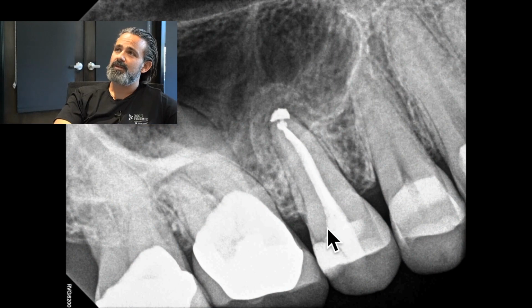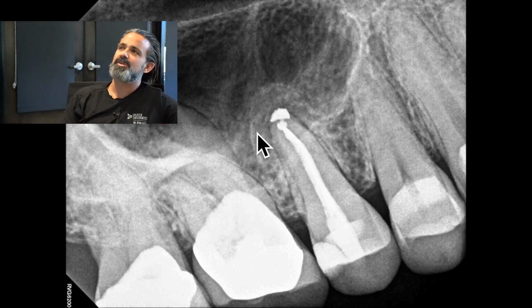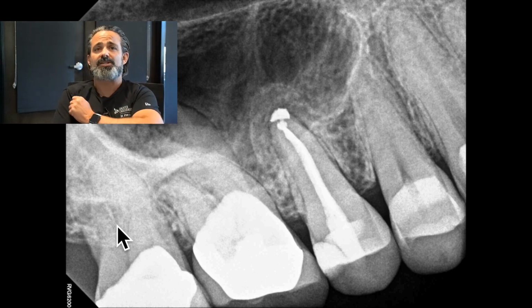And there you go. So you can see that the occlusal access is a little bit narrower than the floor where the two canals come in. Certainly this is what I was filling here at the end with that little bubble, the 2 to 1 back to the 2. And so the GentleWave really opened that up and it really was like a resorption there. I don't believe that part is extraradicular. Then you can see the little tunnel and then the little sealer cap that's over the top of the root there. And that's that. So the next step is just follow up and watch that lesion shrink up.